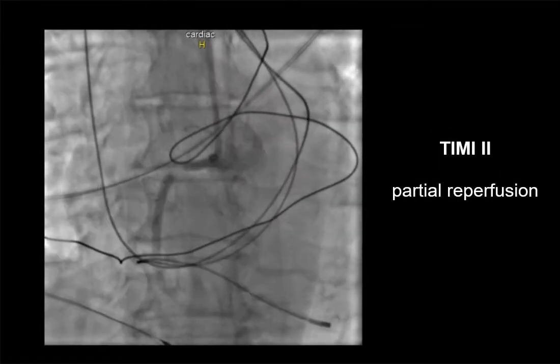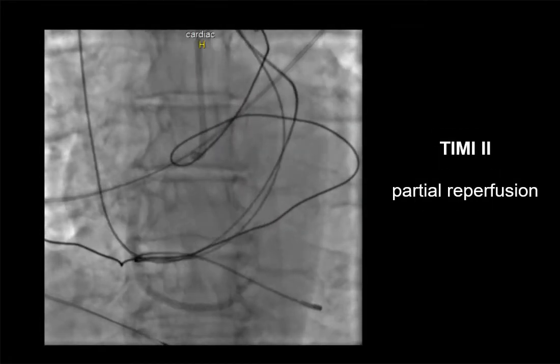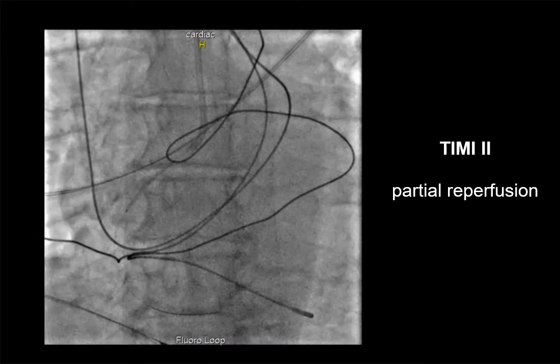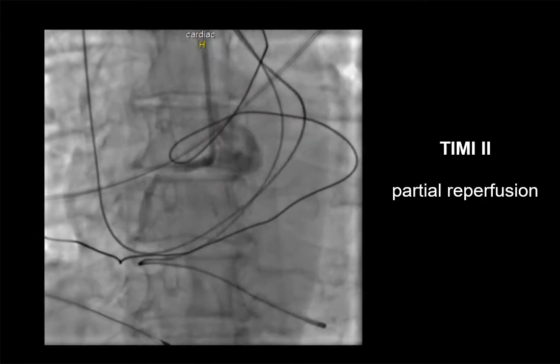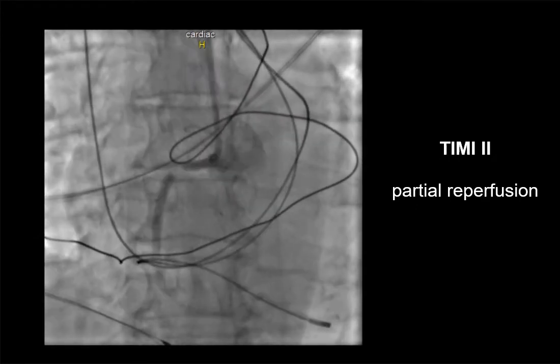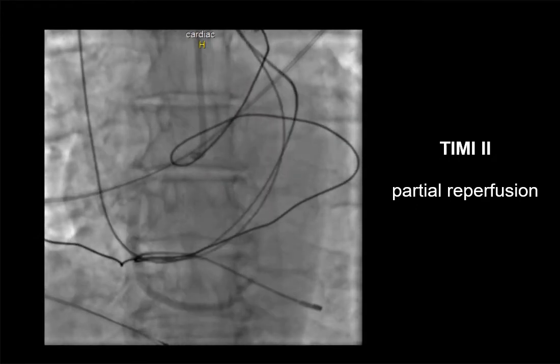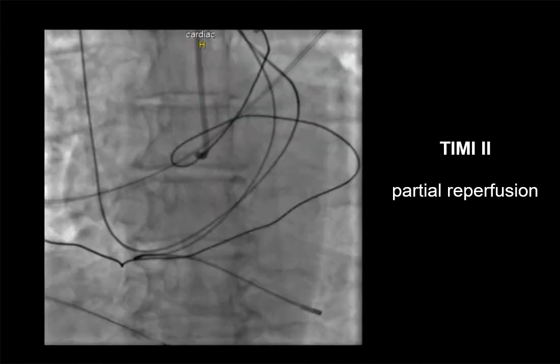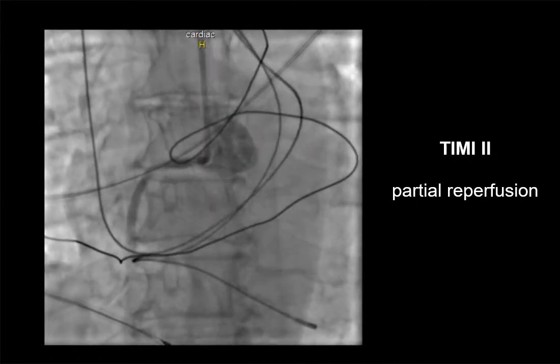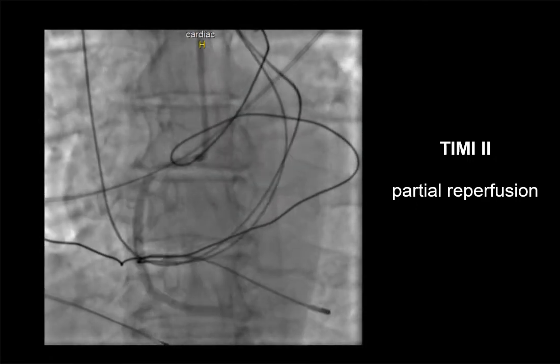TIMI two flow — partial reperfusion — is delayed or sluggish antegrade flow with complete filling of the distal territory. Pay attention to the presented coronary angiography with slow blood circulation in the artery, shown here as TIMI two.